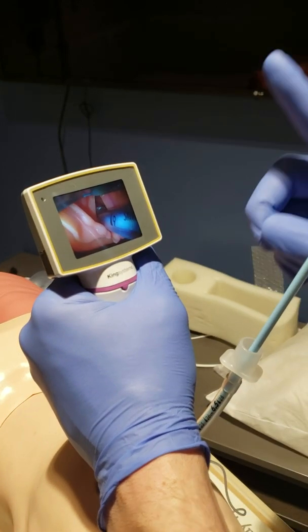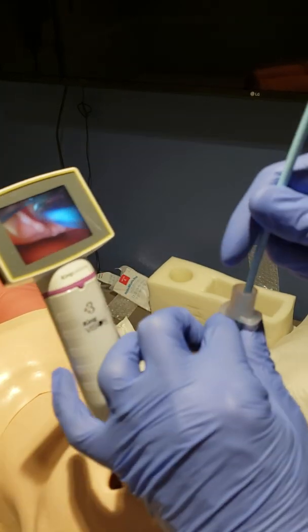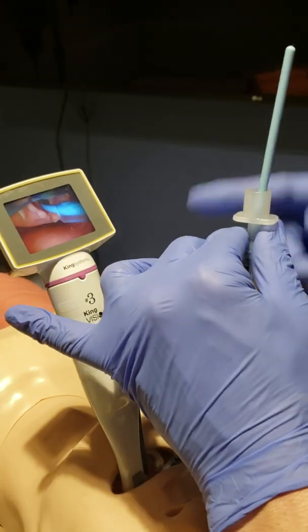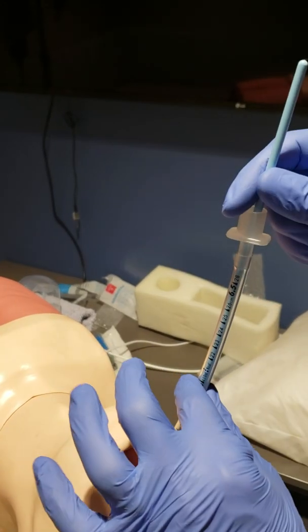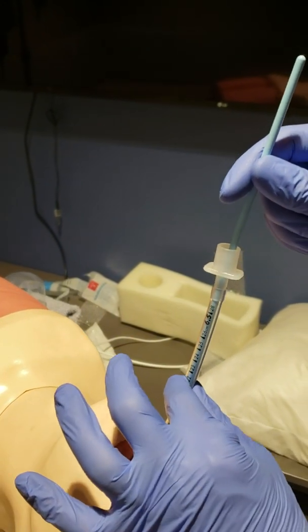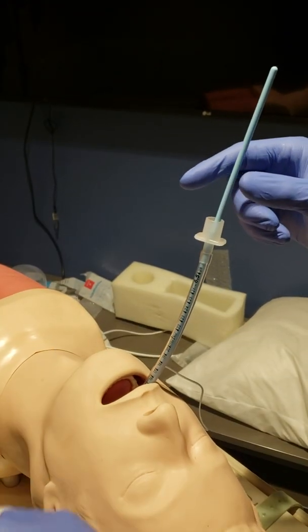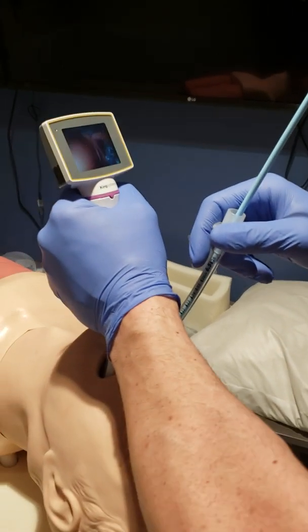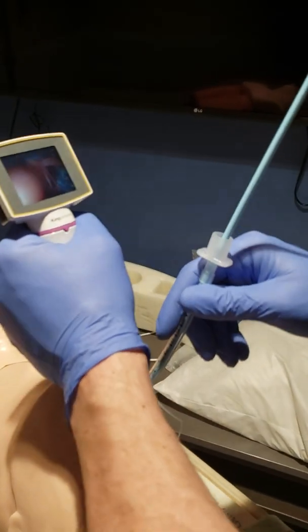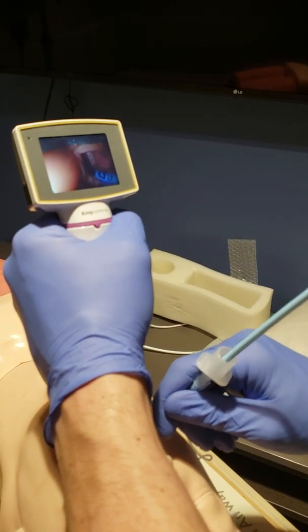This is important for a lot of reasons. One key point is that if you got in originally with the bougie and then removed the King Vision before advancing the ET tube, what could happen is you could hit up on the arytenoids and have a hard time getting through the glottic opening. If you keep the King Vision in, what you're doing is pulling all those tissues out of the way, making the entry of the ET tube into the glottic opening a lot easier.